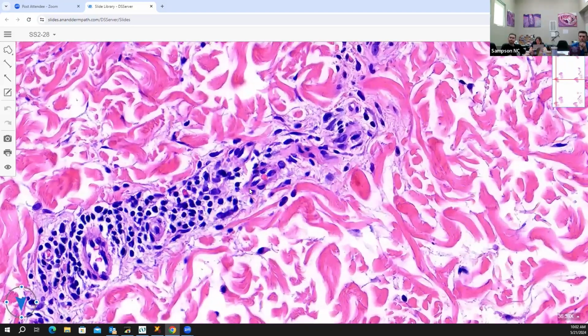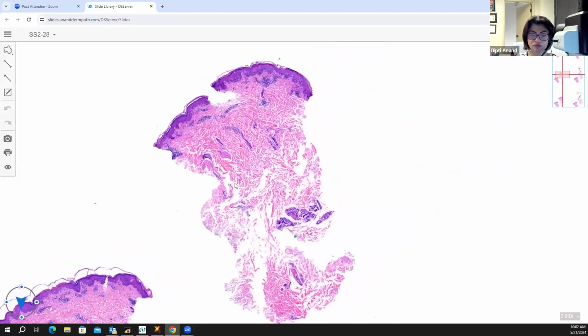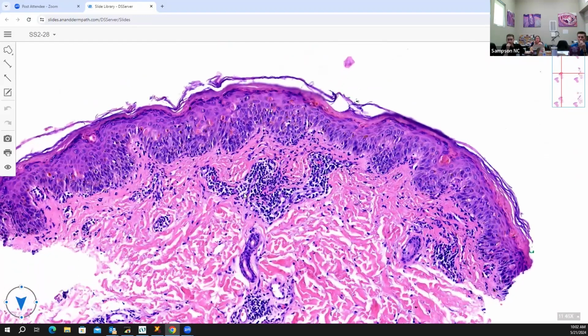This is very acute. Because I thought it was supposed to be more hyperkeratotic, with basement membrane thickening. So this is acute. Yep. But it's not hyperkeratotic. So that's why it's acute. Oh, I see. Yes, we're both arguing the opposite.